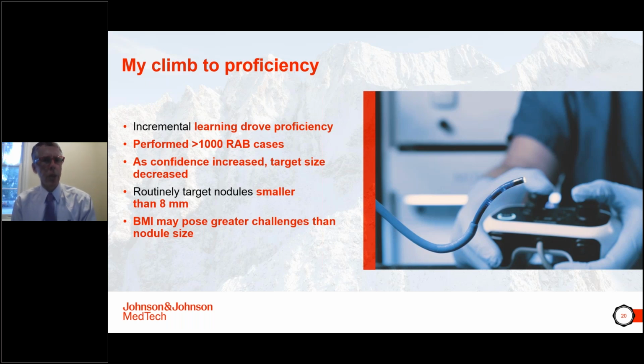And what I found, as I alluded to earlier, is that there is a window of confidence that you have to operate in. So the first 50 patients, it would be better to have a patient selection that is less ambitious so that you can establish your confidence level there. And every technological decision that you make about tools that you bring in really ought to revolve around being able to achieve that 85% confidence window. So if it's necessary to get into that window by bringing in radial EBUS, then there's value for that. If it requires cone beam to get into that 85% window and start growing that window, then there's value in that.